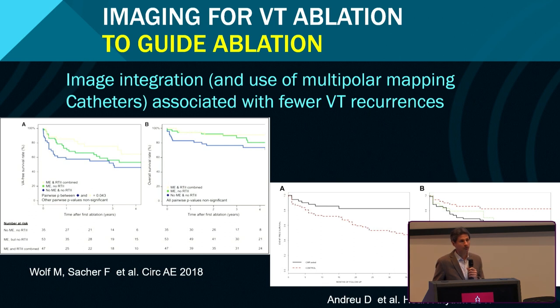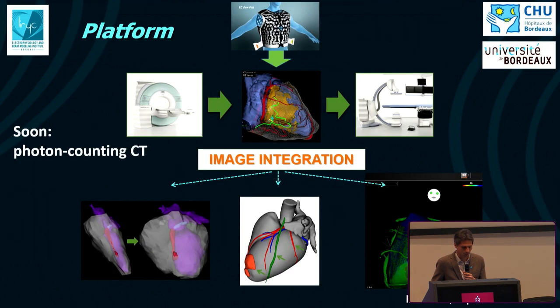There have been some retrospective or historical studies, with all the limitations of this kind of thing, from the Barcelona group and ours, but also other groups in the Netherlands, showing that image integration is interesting and seems to be associated with fewer VT recurrences, or at least better outcome. But all of that was retrospective study and not randomized controlled trials.